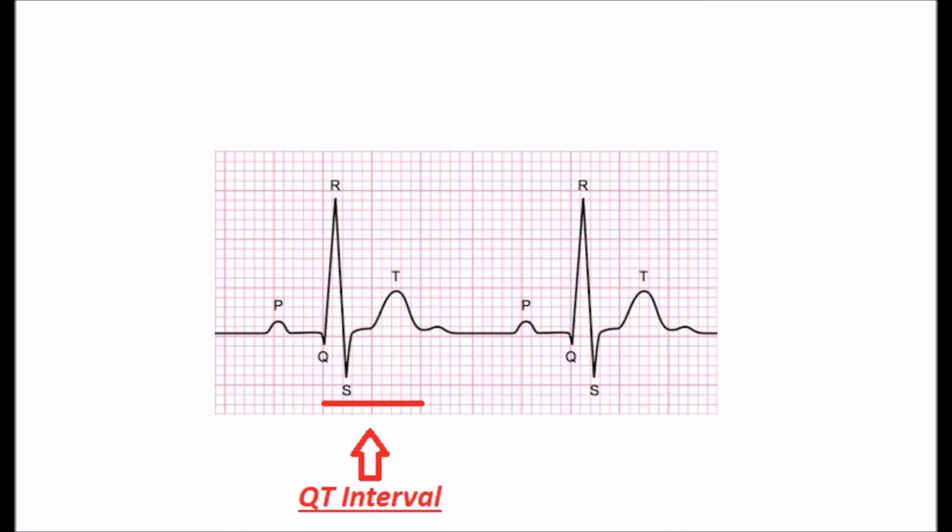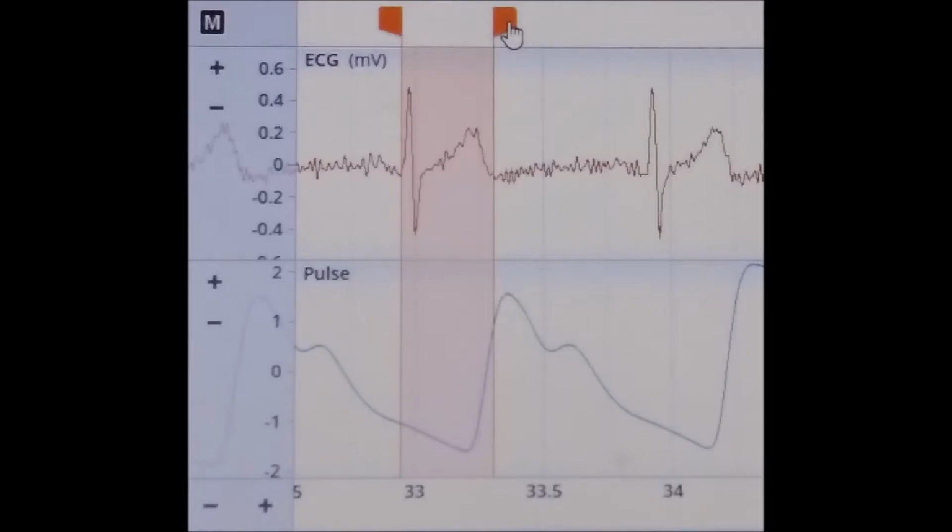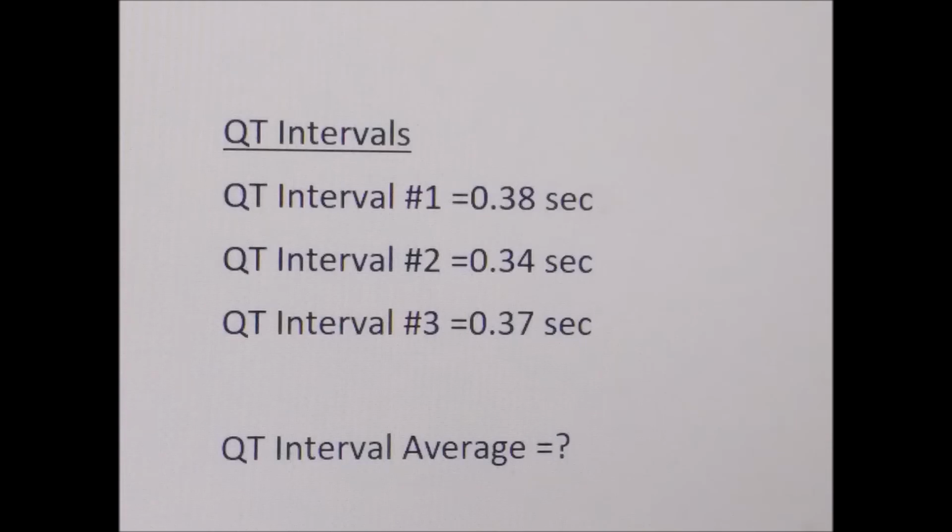Next, I'm going to be measuring the QT interval, which stretches from the point of Q all the way to the end of the T wave. Once again, I'm using the bracket tool, and I'm placing 1 point on Q and the other at the end of the T wave. The data for the 3 consecutive QT intervals I collected are as follows. QT interval number 1, 0.38 seconds, number 2, 0.34 seconds, and number 3, 0.37 seconds.